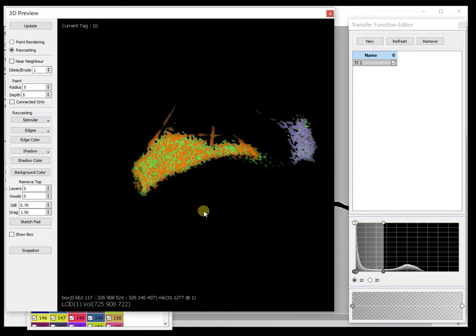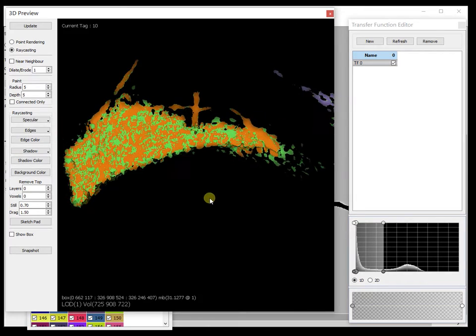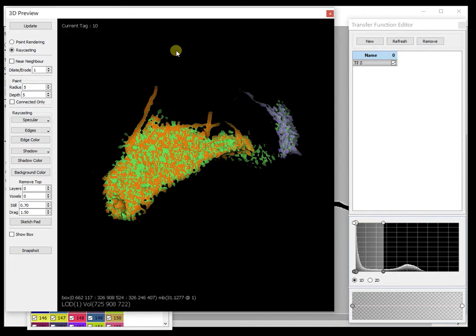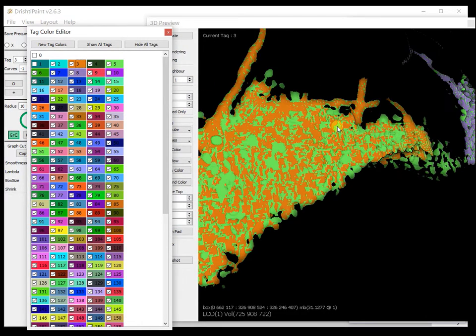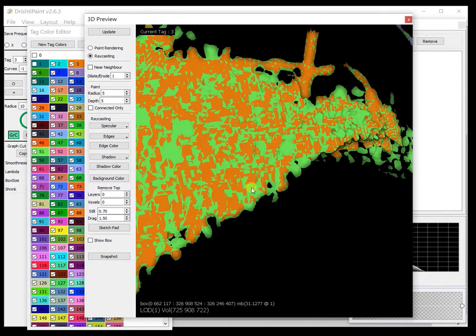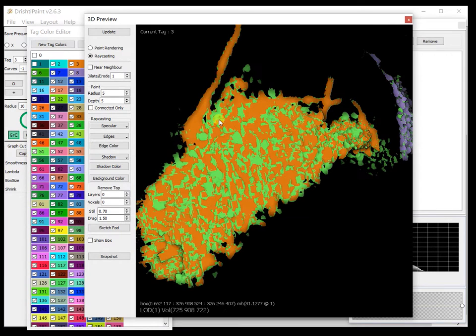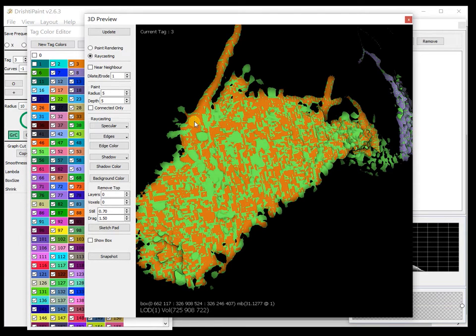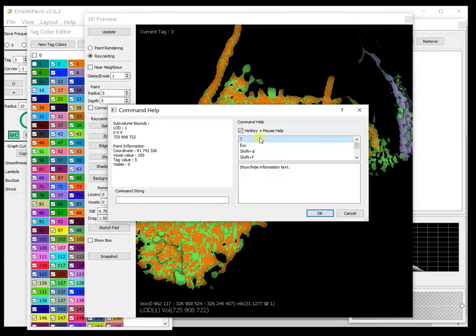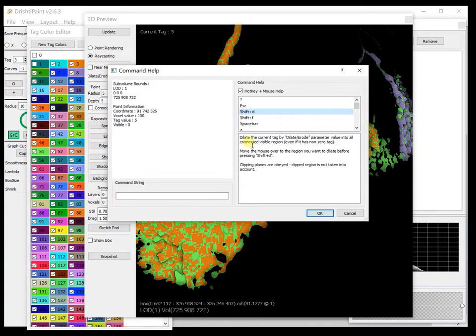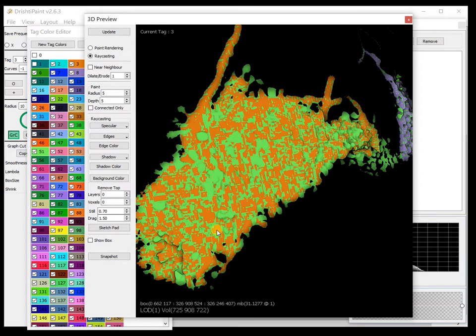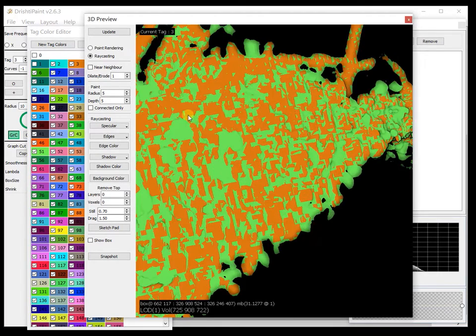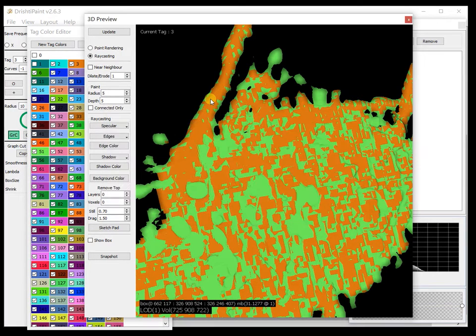So this is how you can segment the interior, the pore structure. Now we have tag three. We can just dilate that tag three. I have selected that tag three and now hover over the region which is tag three and then press shift D. So again I will show you what shift D does. Shift D will basically dilate the connected visible region. It is not just the tag zero region but all visible regions. You can dilate into all visible regions, so that is what we want to do. So shift D, tag five. No, we are interested in tag three, yes here it is.